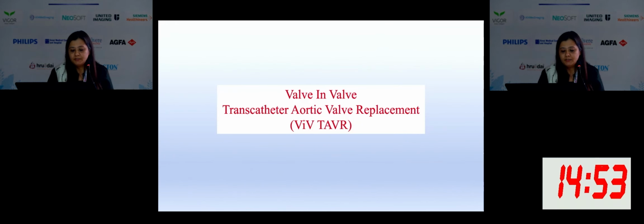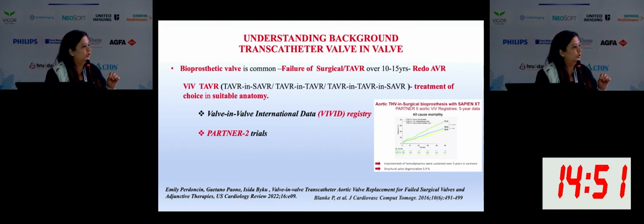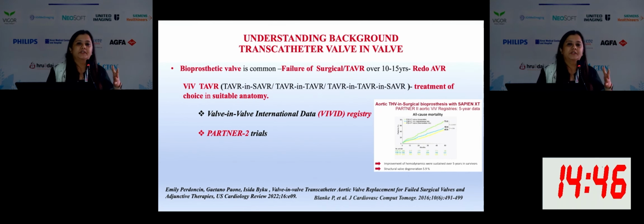In addition to that, we'll start with a small thing. A lot of bioprosthetic valves have been used in the last few years, and we are seeing more and more degeneration of these valves, and redo AVRs are coming up.